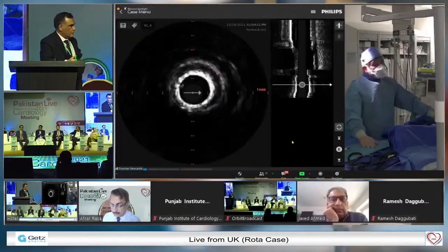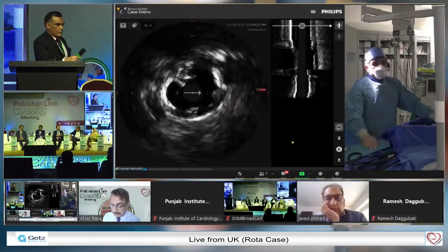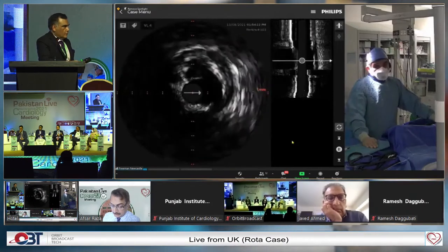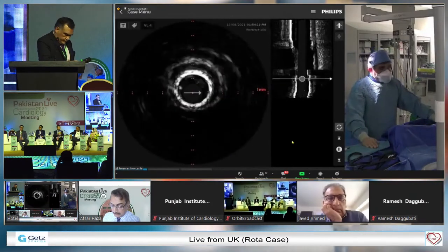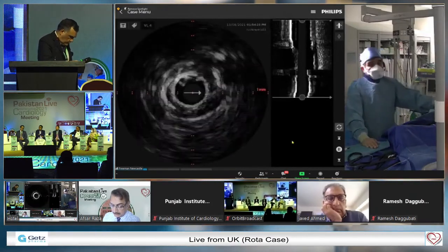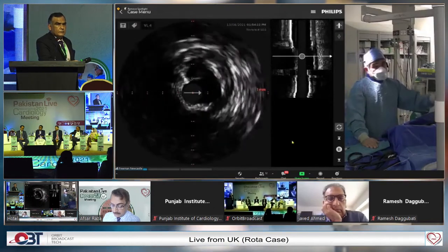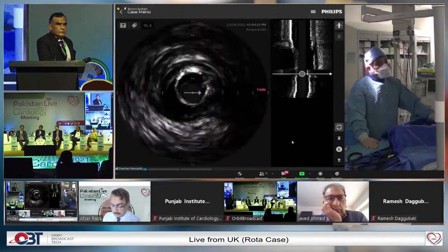Yeah, I mean, that is an argument, but then you're taking the chance of putting a balloon in at high pressure. And sometimes I do that. I don't say that I don't do it all the time. It's just, I think as you build the experience, you know which artery is going to respond and which is not, based on the size of the artery, particularly in this case, this big left.